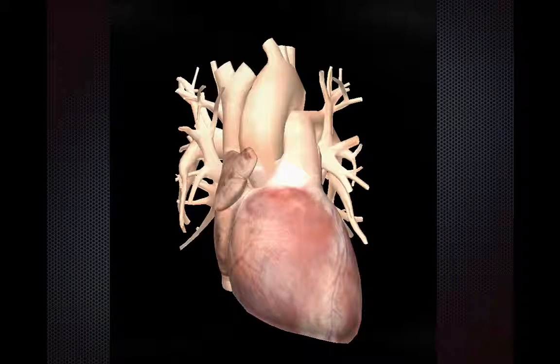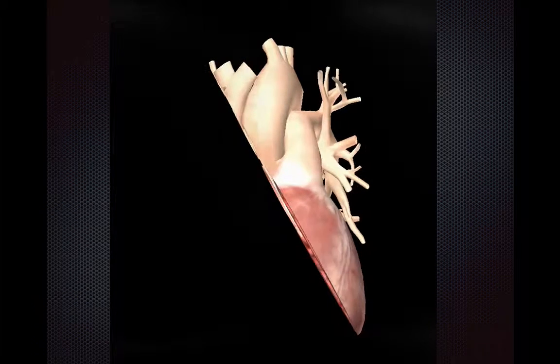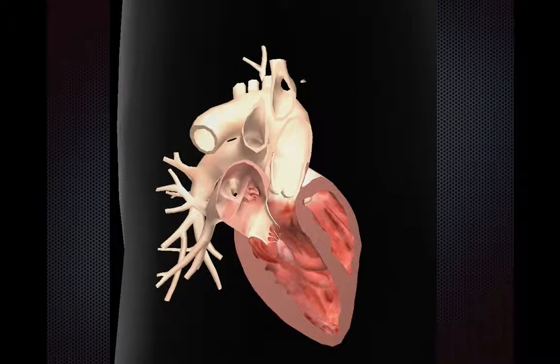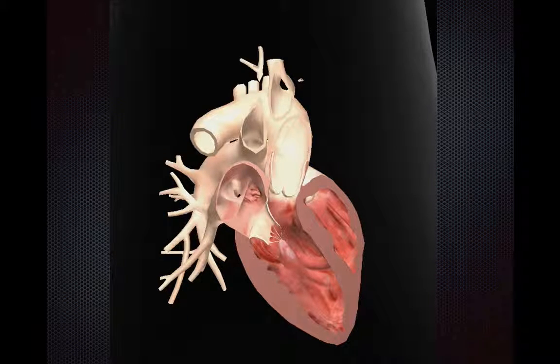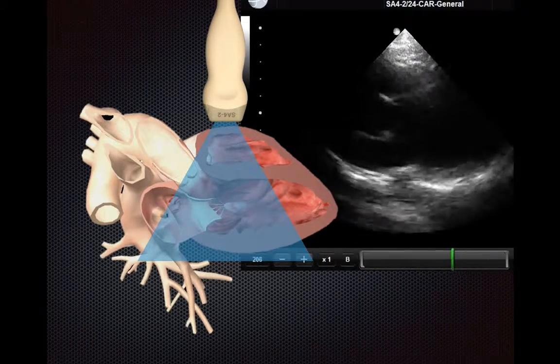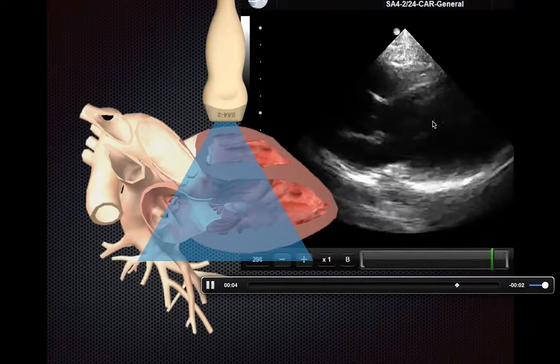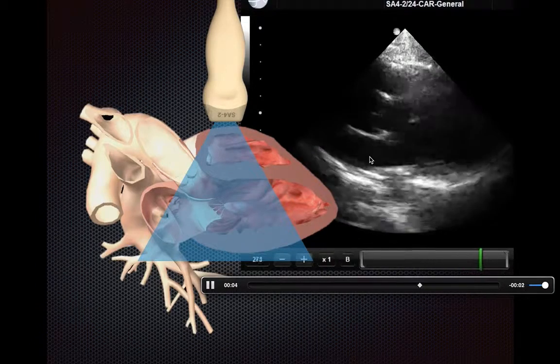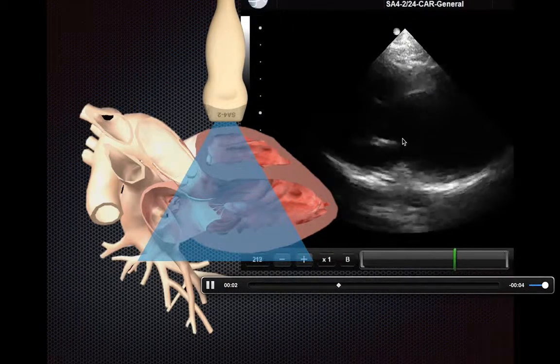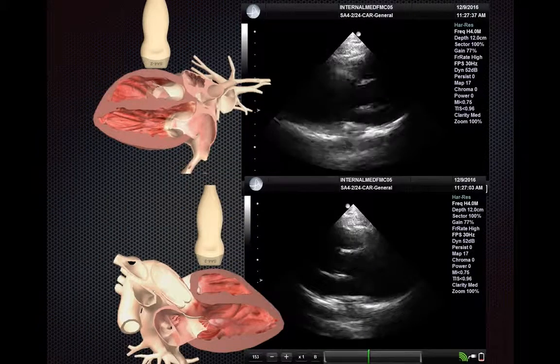There's actually another convention commonly used out there which I didn't cover in my tutorial. In that convention, you take a long axis slice of the heart the same way, except now I'm standing on the patient's right-hand side and looking into the heart — the opposite side from before. This generates an image that is almost the same except it's the complete mirror opposite: right ventricle at the top, left ventricle on the right-hand side with the apex pointing to the right, left atrium, aorta with aortic valve, and a glimpse of the mitral valve.